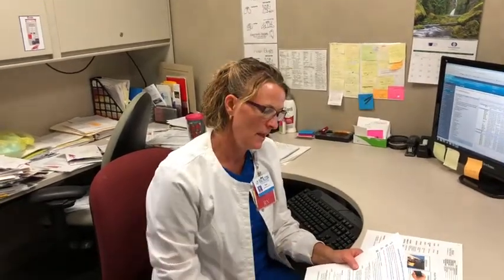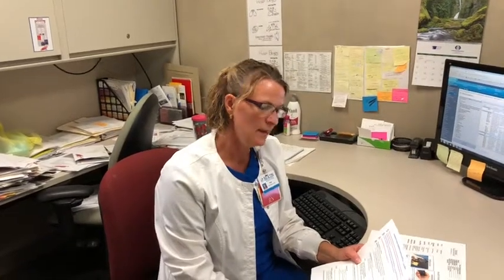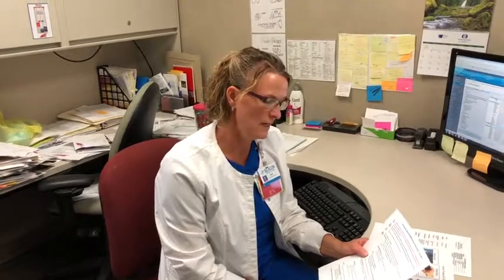So if they have these contraindications, we need to ask them to suspend or remove the pump as appropriate. And you do not have to remove the insertion cannula if it's a pump that has a separate insertion site. If it's an Omnipod, you'll have to just have them take it off. But other pumps will have a separate insertion site. So you just need them to suspend the pump, obtain an order from your ER doc to discontinue the pump, and obtain alternate insulin regimen orders for their ED stay.